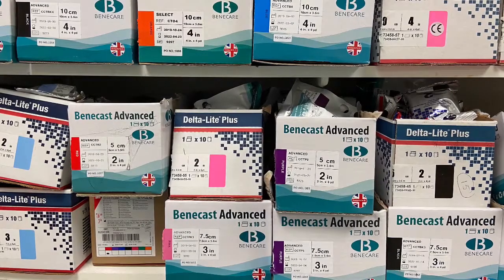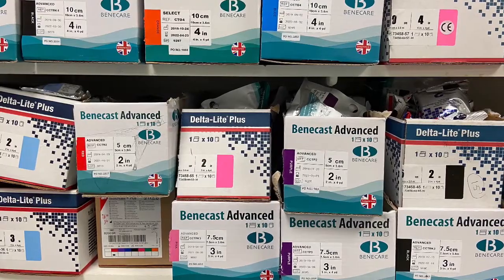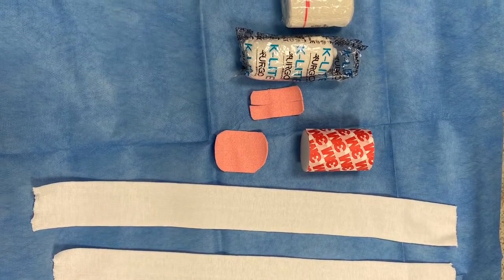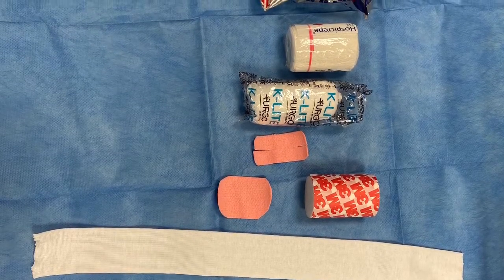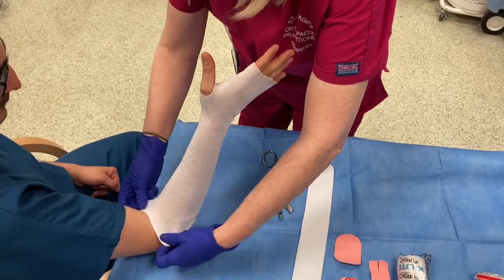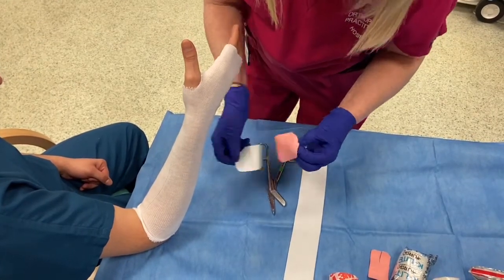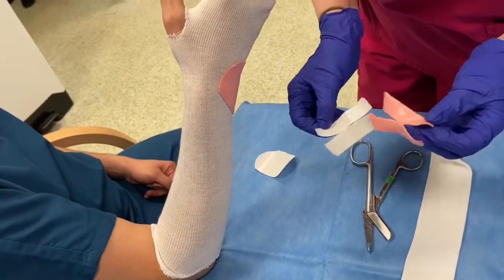Once the initial swelling has gone down, the back slab is often replaced by a fibreglass cast. Fibreglass is lightweight, sets rapidly, and comes in a variety of sometimes quite lurid colours. The basic principles are the same as the back slab; however, because it is going to be on longer, particular attention is paid to the pressure points which may need extra padding. Typically a tubigrip bandage is applied first — again this is longer than the final cast — and then extra padding is placed around the pressure points, which are the ulnar styloid and around the first web space where the cast has a habit of rubbing if you're not very careful.